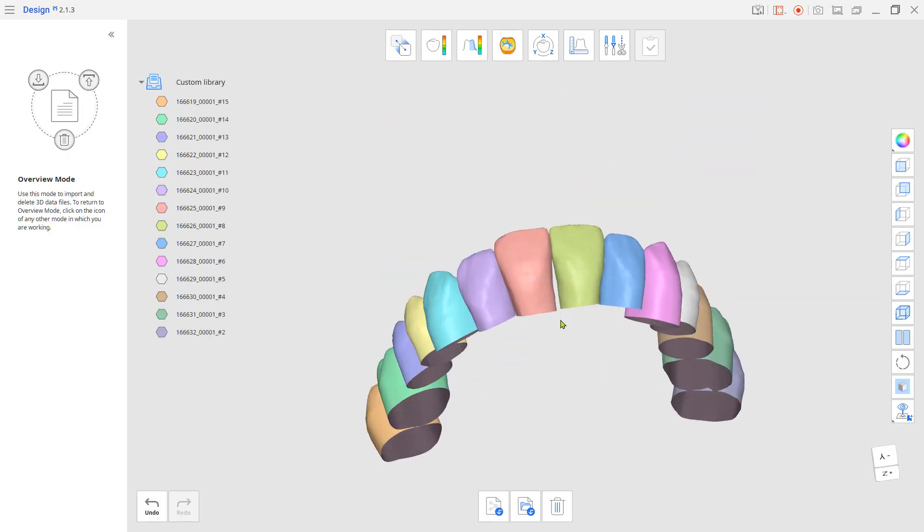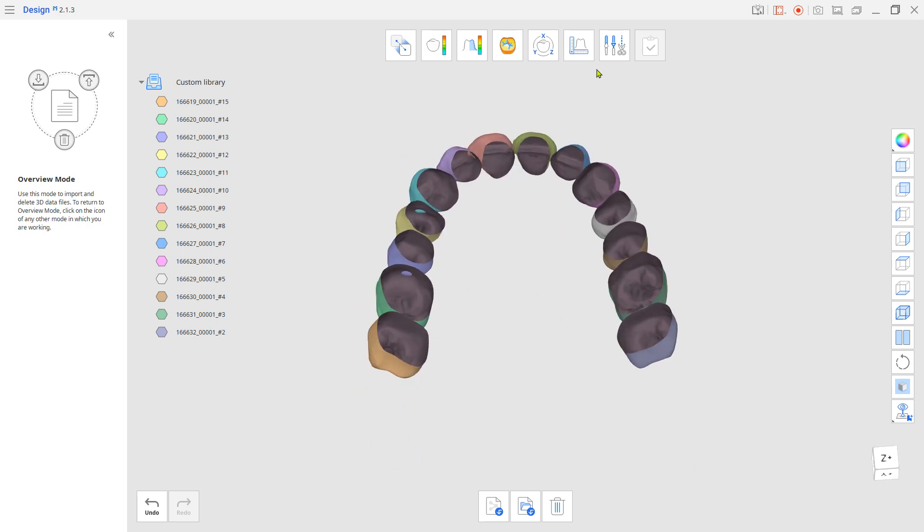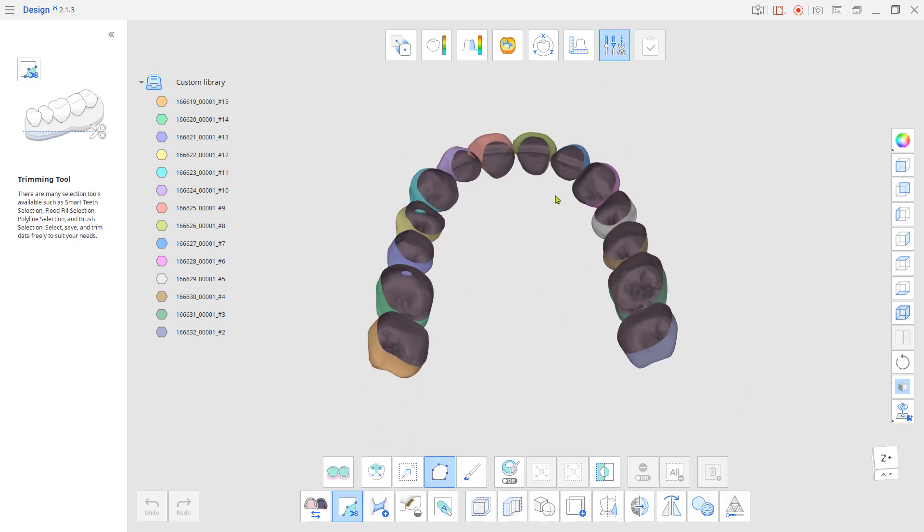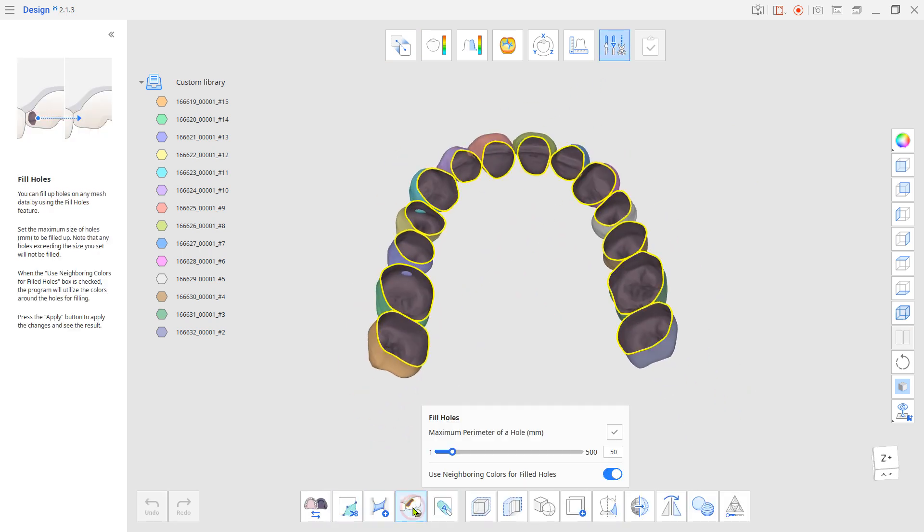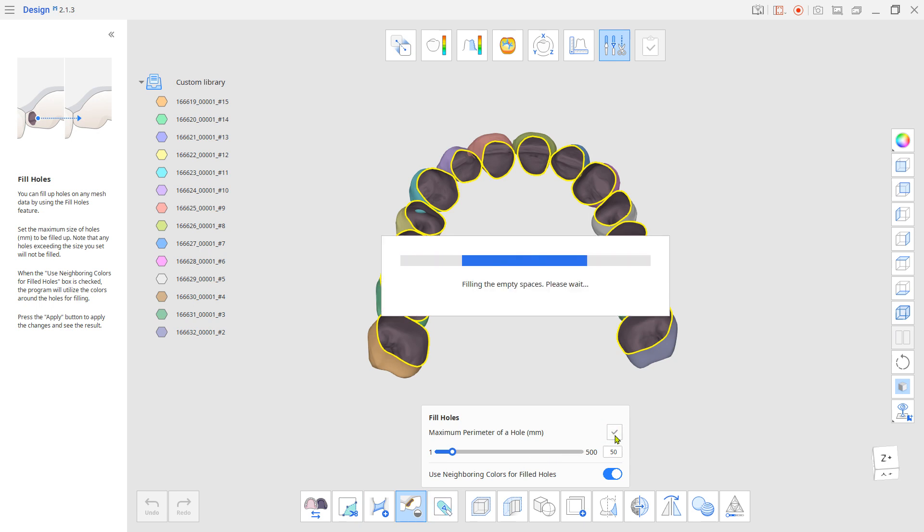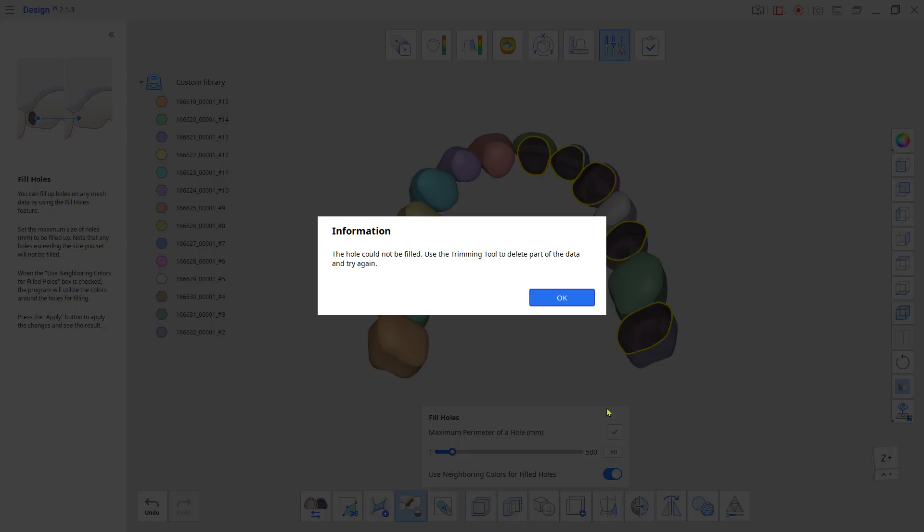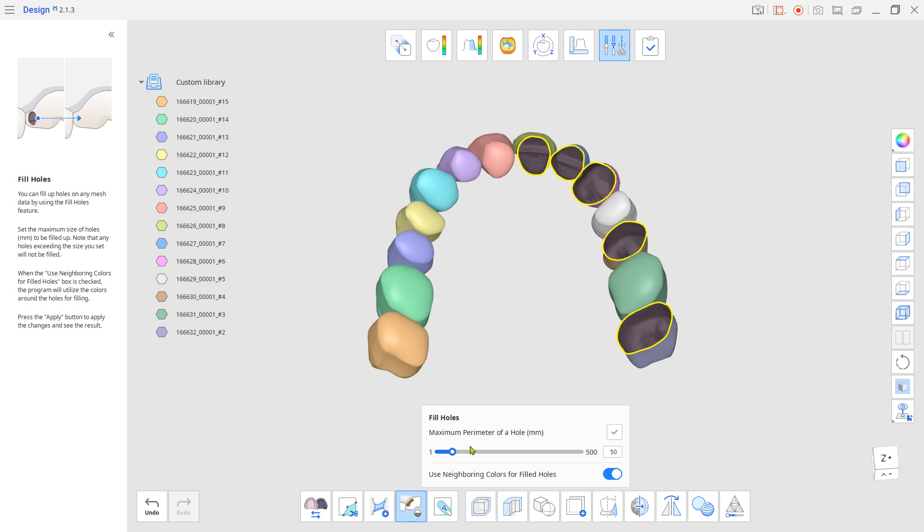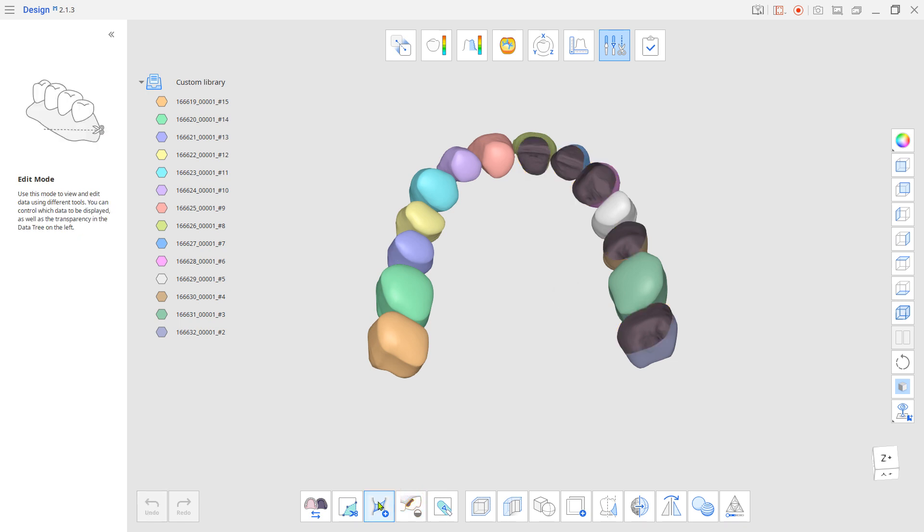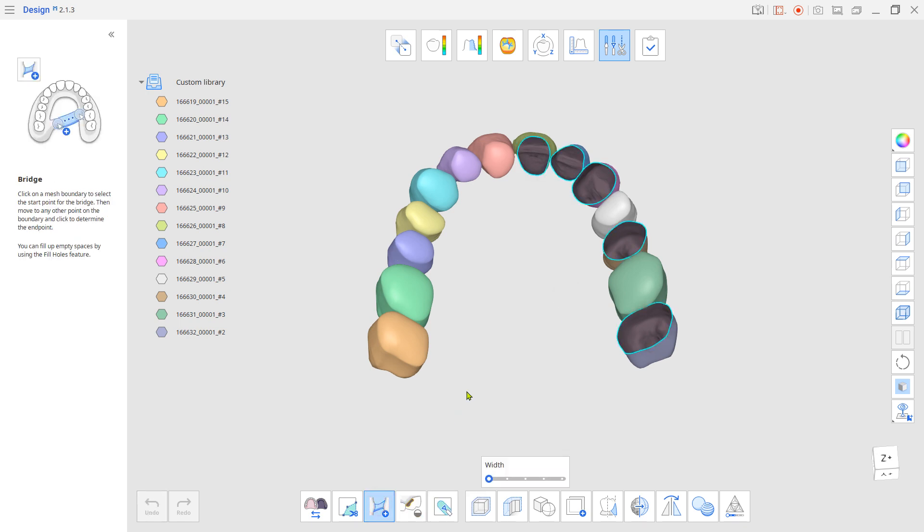Go to edit mode. Use fill holes to close the opened base. If some teeth's bottoms don't get closed, use the bridge tool to connect the area and try again.